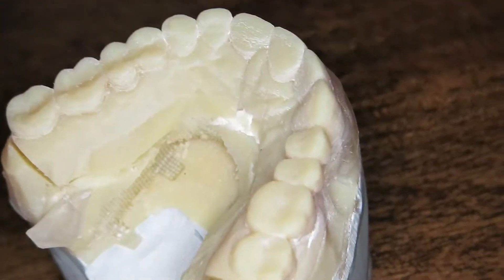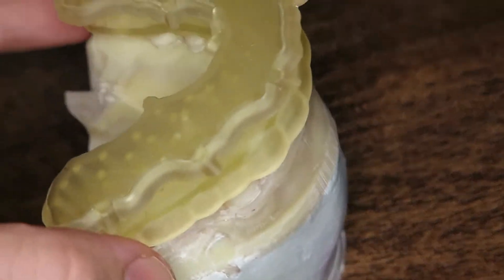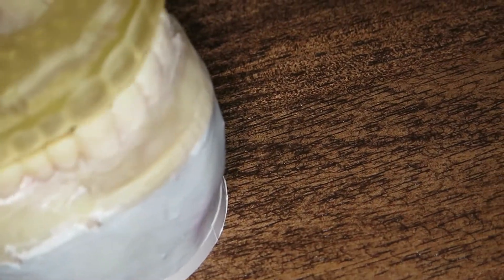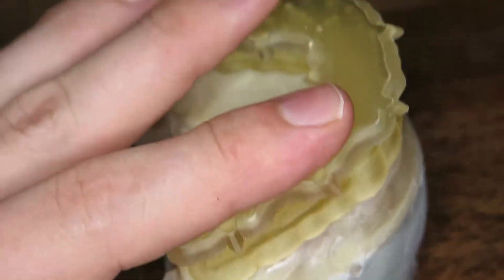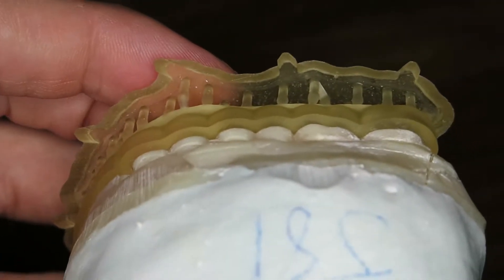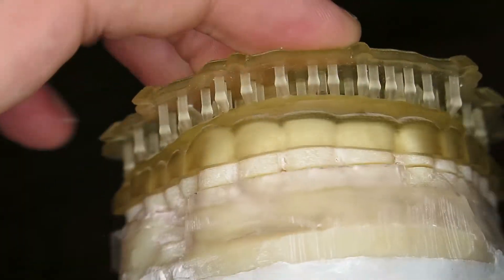This model is pretty passive, and in fact the occlusal guard that the lab sent back had Adams clasps on it. This one also fits, once it's on, pretty passively. It's very stable — absolutely no rocking. The fit is quite intimate and quite accurate.